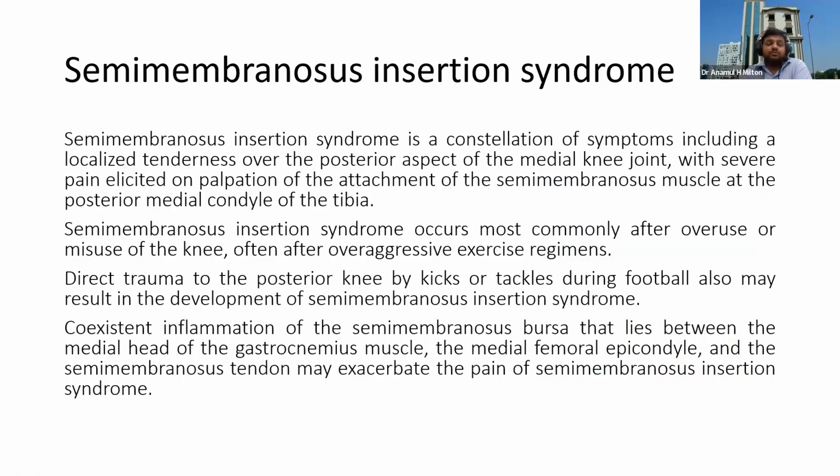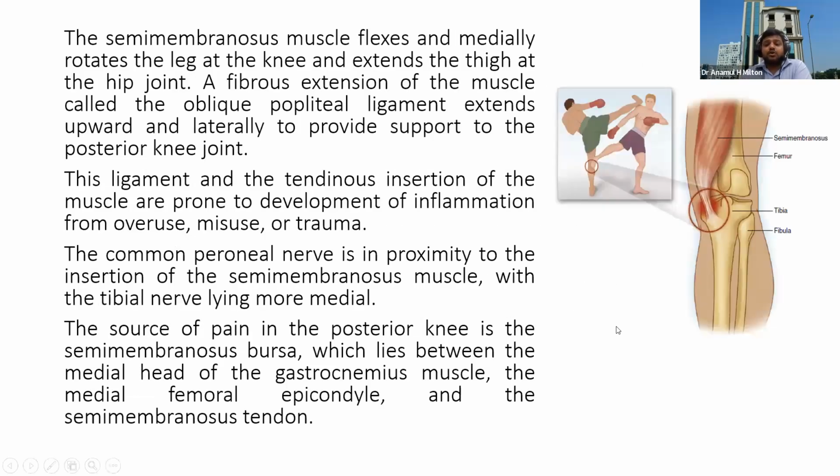One important bursa lies just under the semimembranosus, and it is often affected if there is coexisting osteoarthritis. So always do an ultrasound of the semimembranosus insertion area and check whether there is pain or not. Many athletes or players may get this.